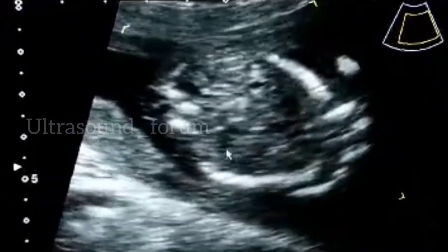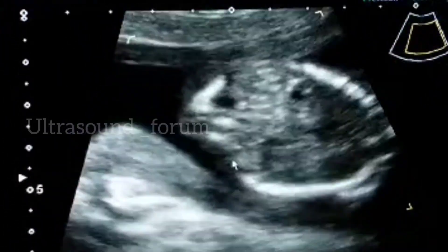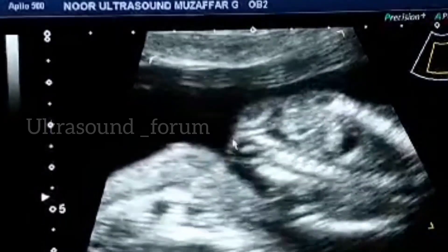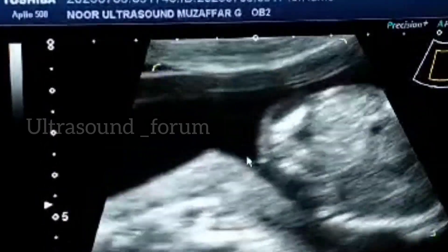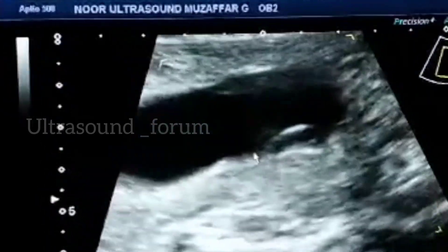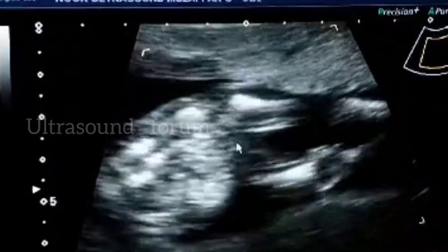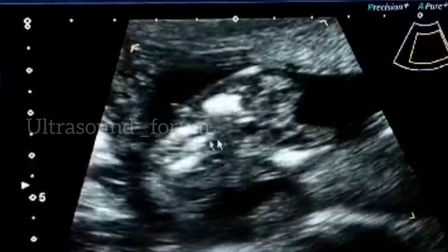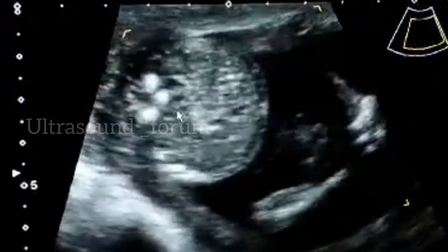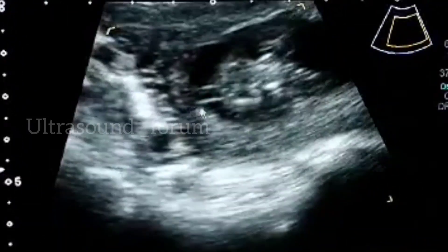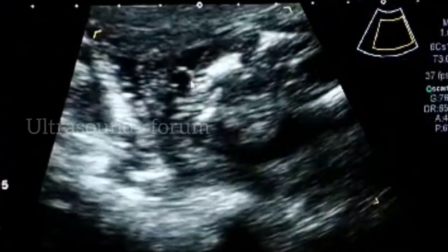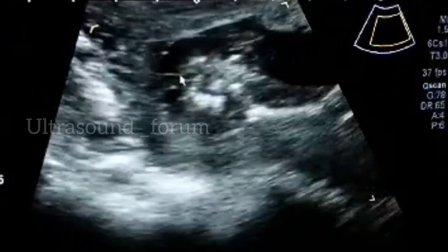Now we come to the spine. You can see this is the meningocele — there is spina bifida. This is open spina bifida with the meningocele clearly visible.